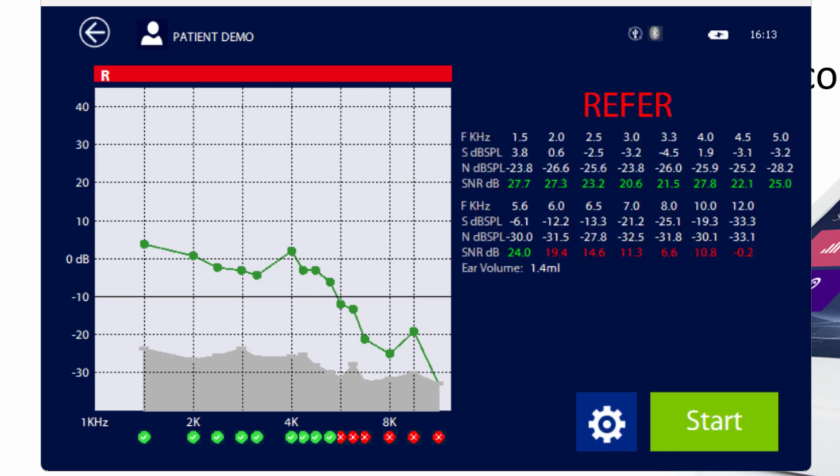So now that is done. This is actually quite a nice measurement for someone my age. I'm sure that my hearing in the highest frequency is not the same as when I was 20 years old. So that the OAE is at a lower level there is completely normal, of course. But still, it turned red there. If we look at the numbers, then the signal to noise ratio might be big enough, but still it turned red.